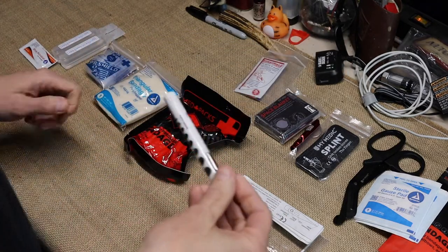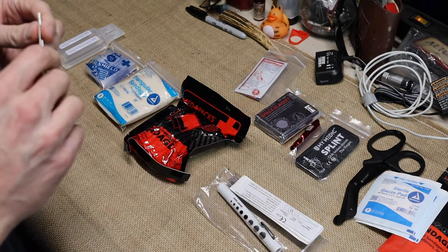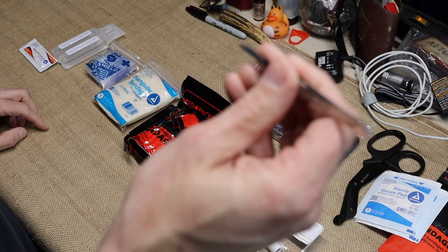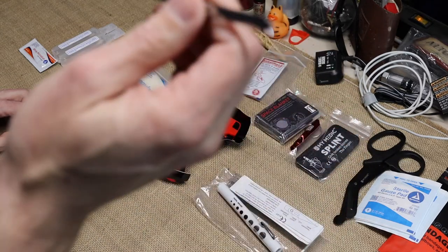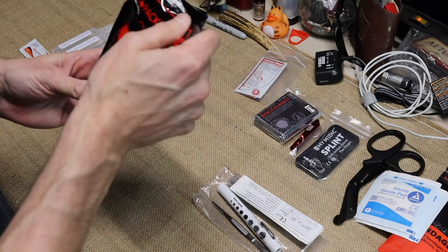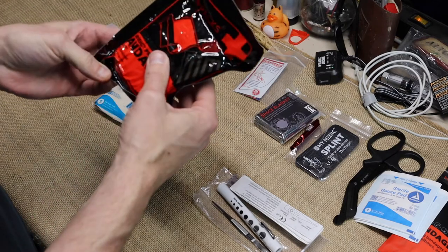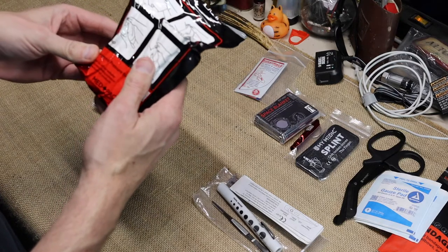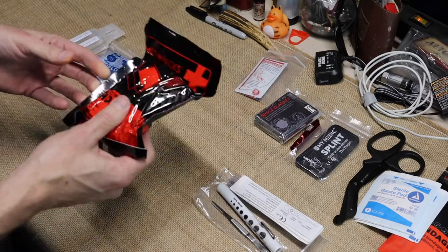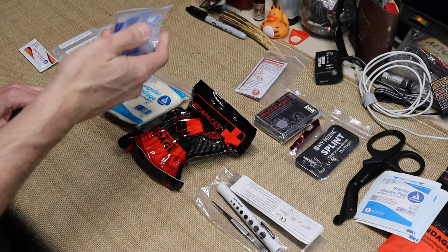I don't know enough about pupils yet to know what the different sizes mean. They also have needle tweezers — broad tweezers just don't work as well for getting a splinter out. Next you have an emergency pressure bandage, kind of like an Israeli bandage but without the locking system. Then you have your typical triangle bandage and a CPR mask.